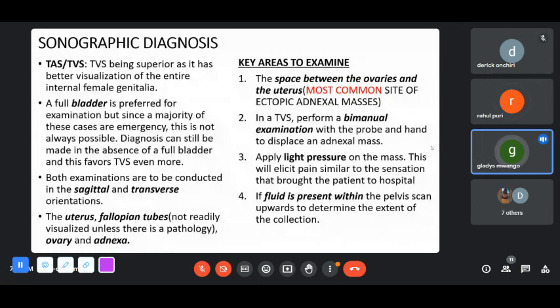Okay. Was this the first time that she was coming for an obstetric scan? No, she had one before. So it was a follow-up scan, and what was the indication? So they wanted to know the umbilical RI and the AFIs. So you are not able to do that, is it?